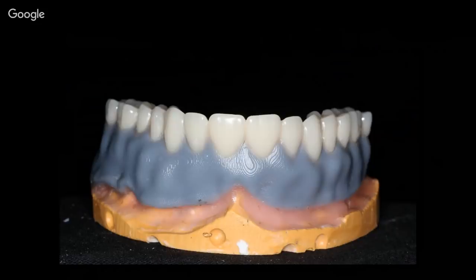So remember, if you're going to do this and try to fit it back on a master model like you see me doing right here, it would be imperative that back at the step where you begin developing the bases, you do not allow undercuts, because if you've got undercuts, there's no way this is going to have a path of draw. And I would also create a bit of an offset space of maybe 0.3, 0.4 between the model and the base to account for any potential shrinkage or inaccuracy or whatever.